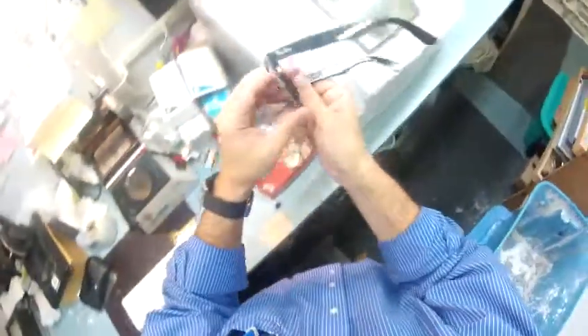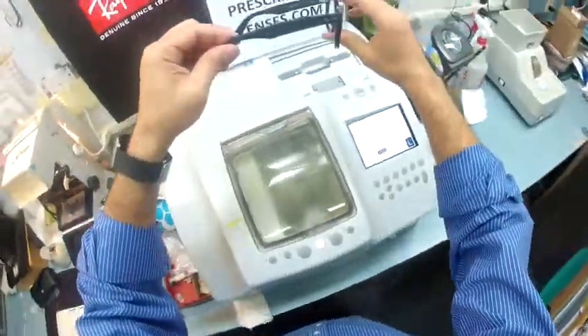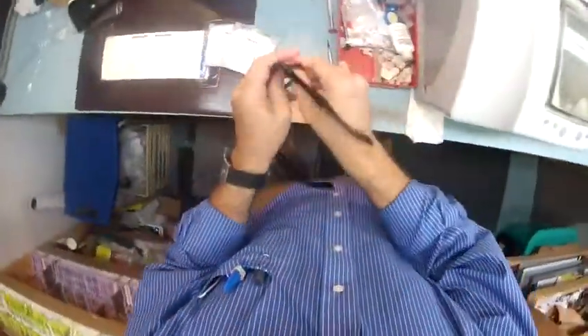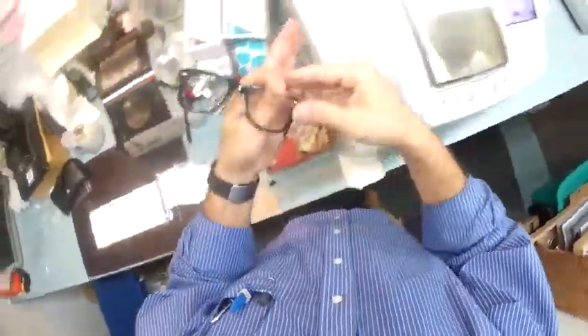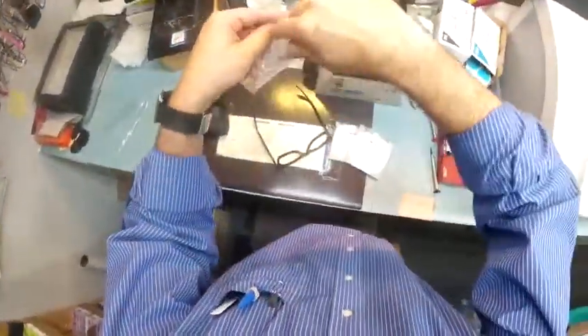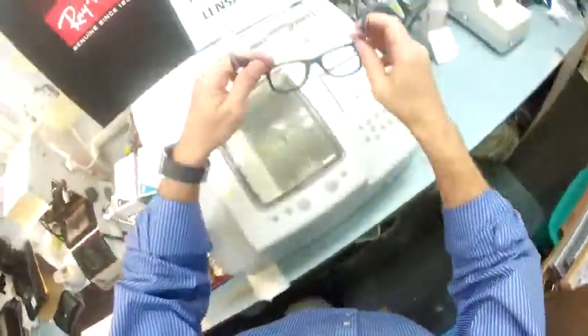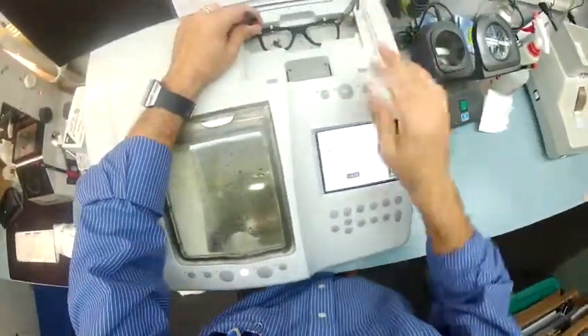Let me take everything off so I can go ahead and get started. This is your classic original Wayfarer look with the demo lenses. I'm going to remove those. These are the ones that say Ray-Ban on there, so I'm going to save these for you. I'll put them in the bag so you will be receiving everything that Ray-Ban sends to me. I'm going to put your Wayfarer frame into my Italian Santanelli LE-1000 patternless edger.